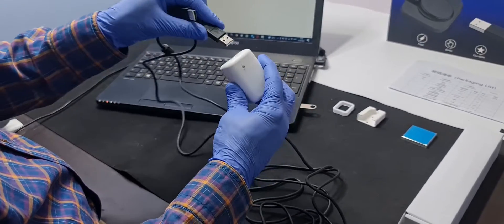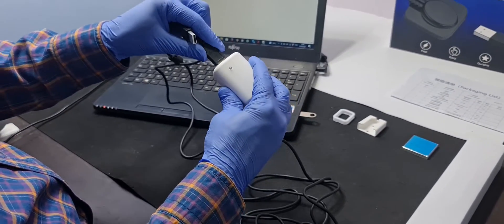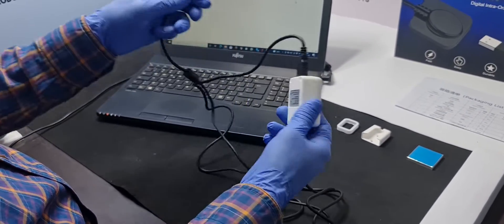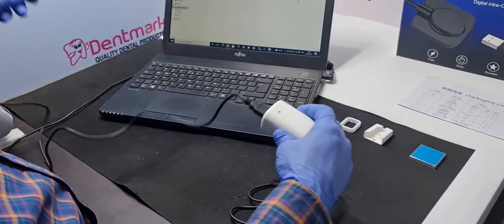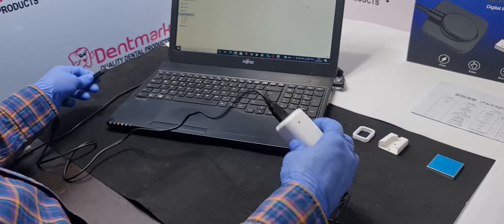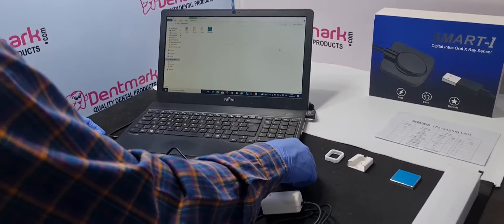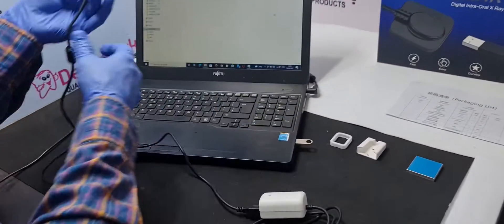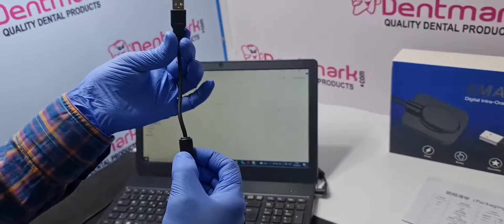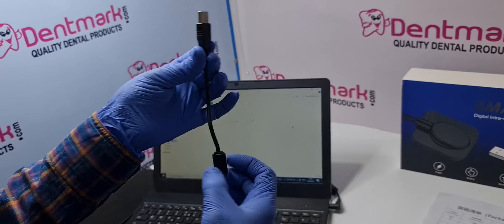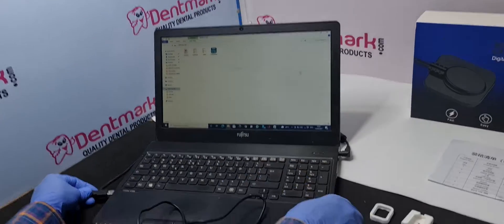So attach this USB cable to the controller of this RVG sensor and other end with the USB cord where the magnetically shield is there.